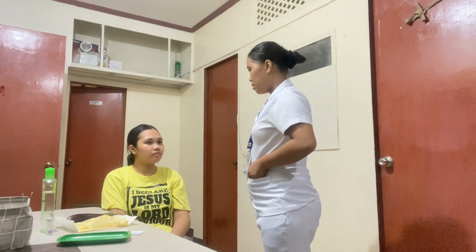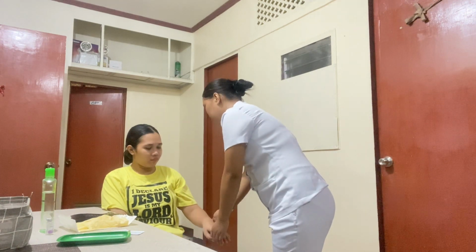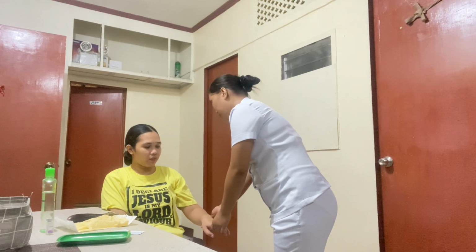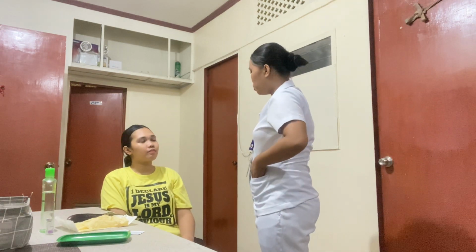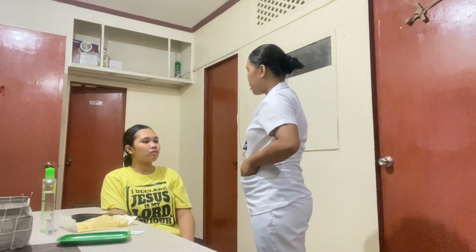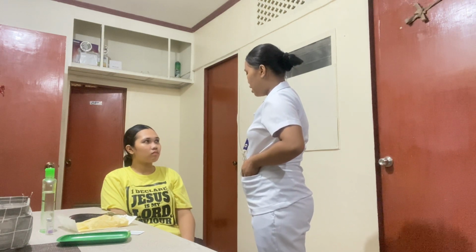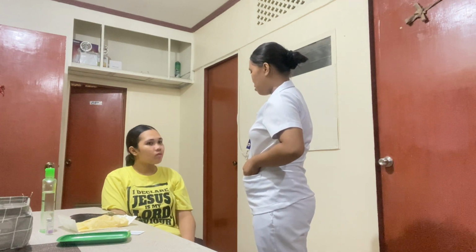Good morning, ma'am. My name is Grace, I'm your student nurse for today. May I see your wristband, ma'am? Please state your complete name, ma'am, and also your birthday. I am Tanya Garcia, December 27, 2000. Okay, thank you. So now, ma'am, I'm going to do the intradermal injection. When I'm entering the needle into your skin, you may feel slight pain, and it may also produce a little blood. Is it okay with you, ma'am?